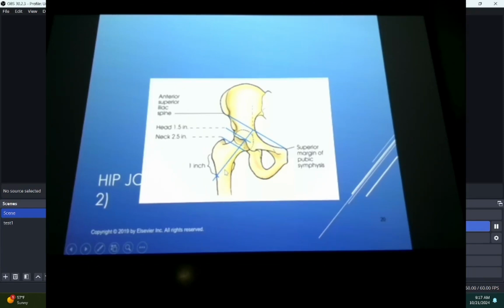All right. So if we're looking for the hip or the proximal portion of the femur, we want the long axis of our collimation pretty much running parallel to this. The reason I say that is because you want that covering your photocell. It's the hardest part of the anatomy. It's the thickest part of the anatomy.